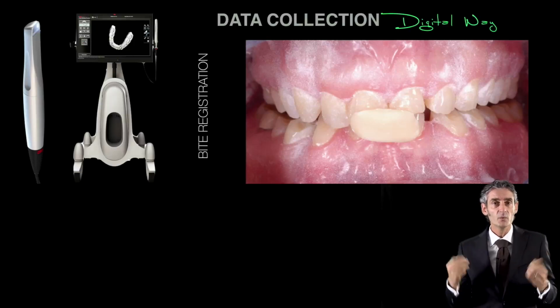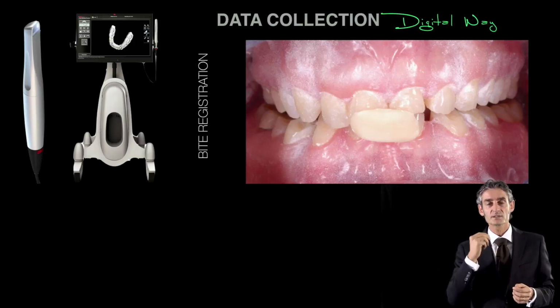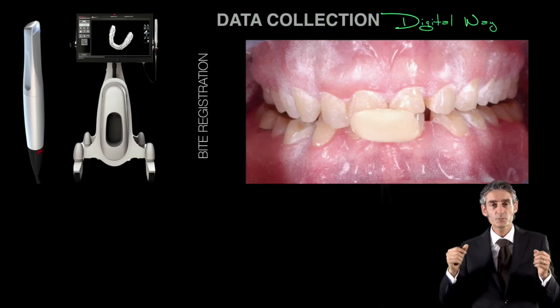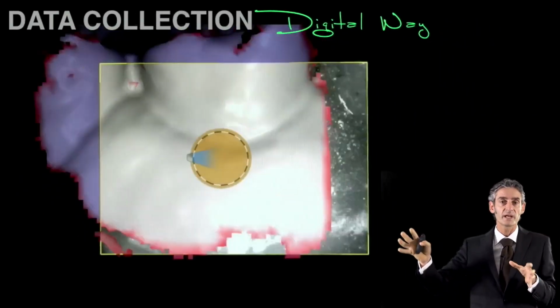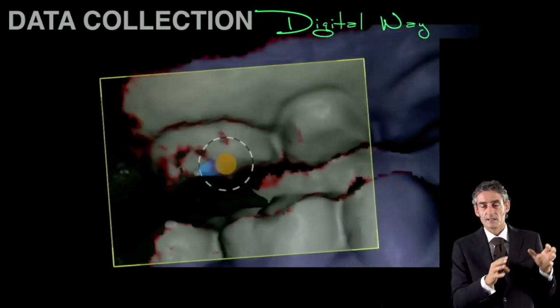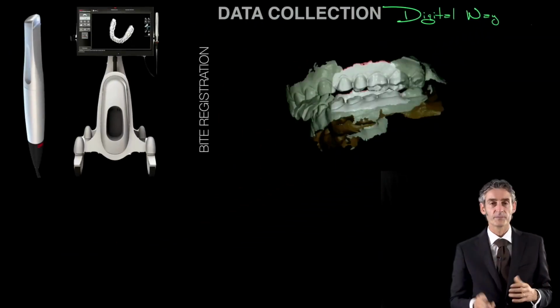We don't need material. We don't need plastic foil. We don't need anything. We only need the anterior deprogrammer. We ask the patient to move forward, backward as before. We put the position of the mandible right as it was before, and then instead of putting the material, we have to scan the arches in the way that the software can record the position of the teeth, and it will bring exactly the arches in the position that we put. So for us it's important to understand that the concepts in the back are exactly the same, nothing changed, and it's a different way to obtain the same result.